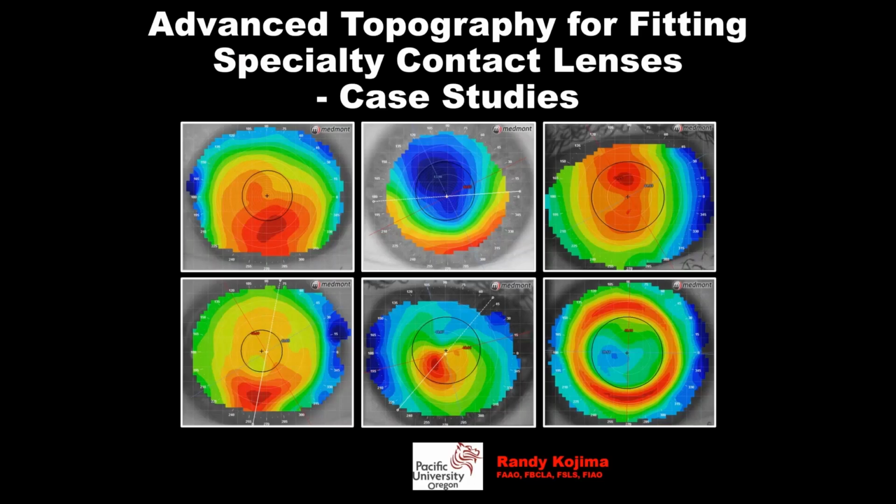This talk today is on advanced topography for fitting specialty contact lenses. And again, my name is Randy Kojima. What we did was we took about 10 consecutive patients that we had performed topography on, and pulled out of those cases what we might discuss, what was interesting about these particular topographies and these particular conditions that would be good discussion points for us to have. So I hope you'll like this format that's a little more workshop style.